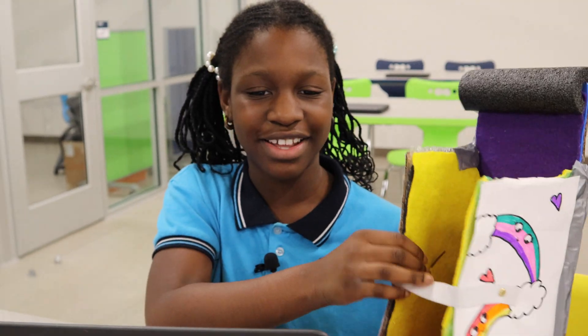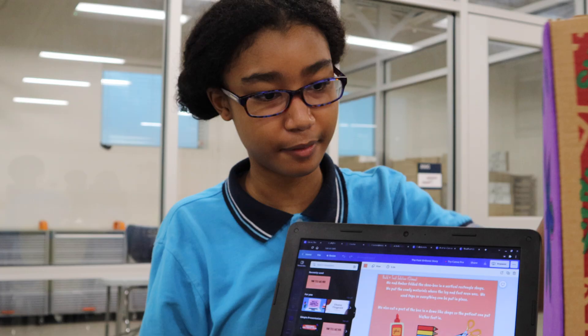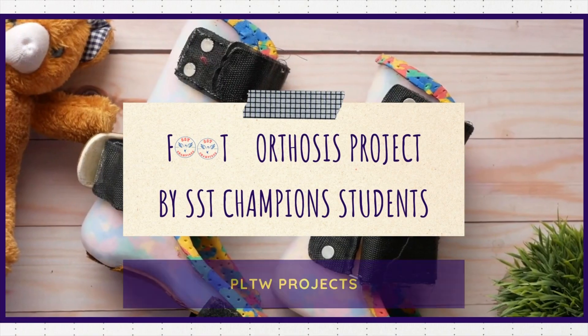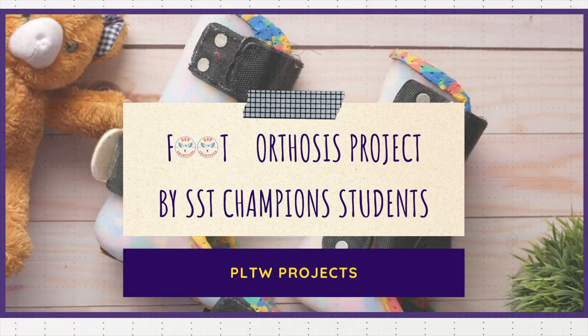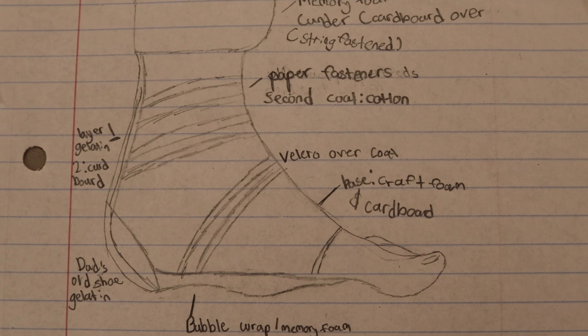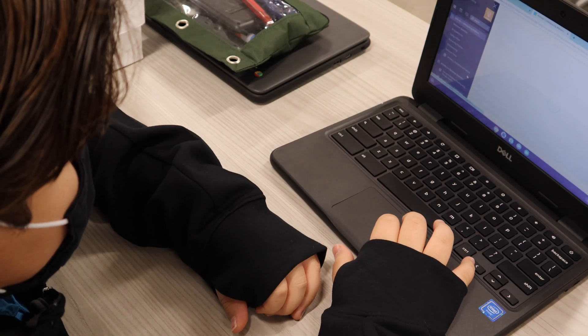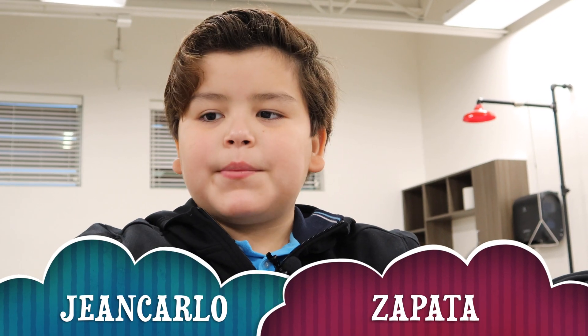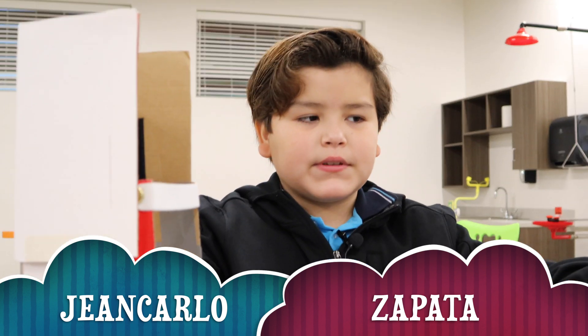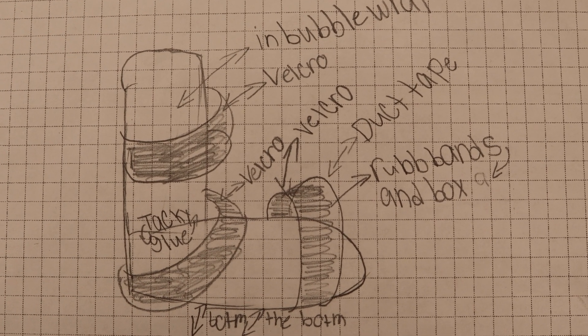This is the foot orthosis project that I made. I made it because some kids have difficulties with walking, their legs, something like that.